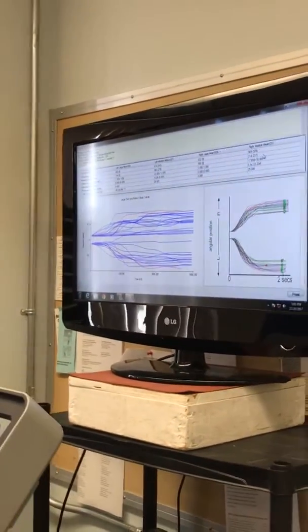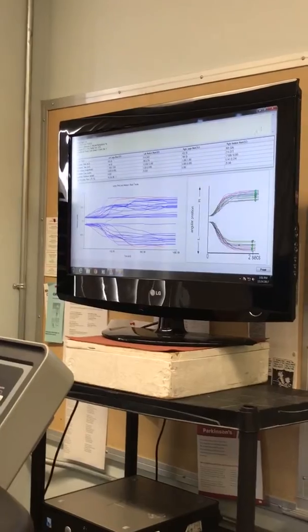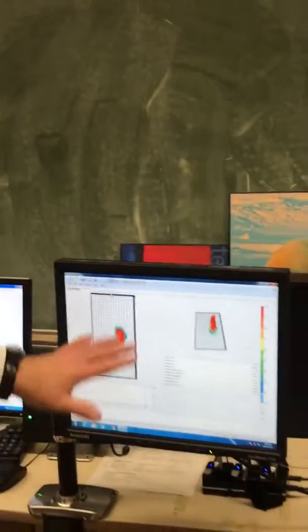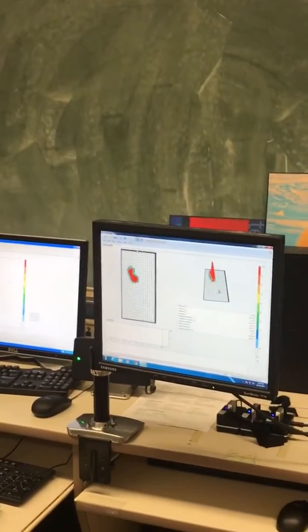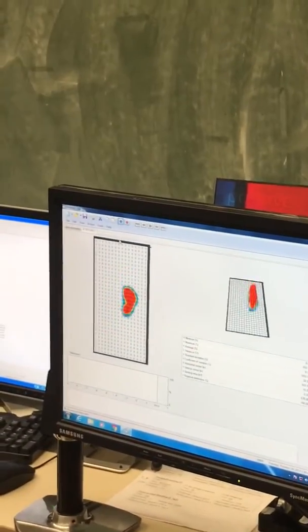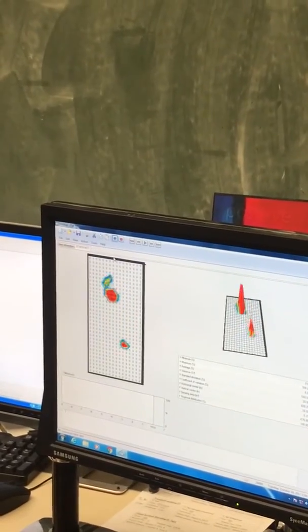So he's just finished a 60-second game, and that's his cognitive performance, and this is his physical performance. Now, what would the physical performance be based upon? Like steps per minute? No, we get step length, step width, step time, swing time, single support time, and we take the average of 60 steps, so we take the coefficient of variation of all the spatial temporal gait variables. So it's gait on a treadmill.